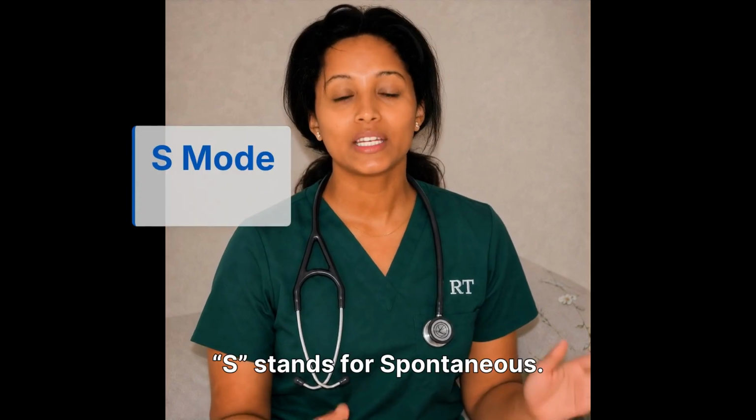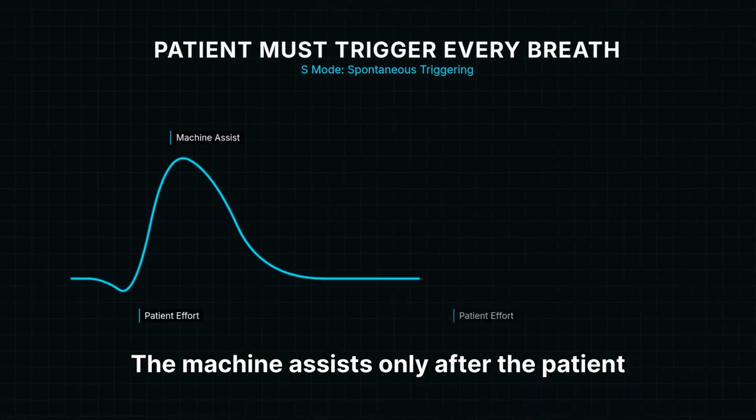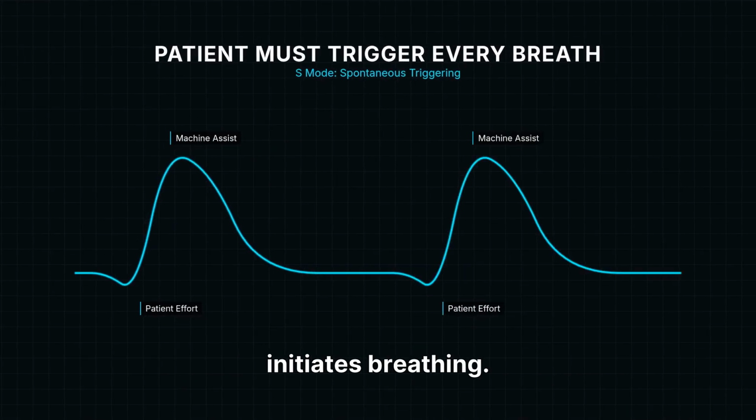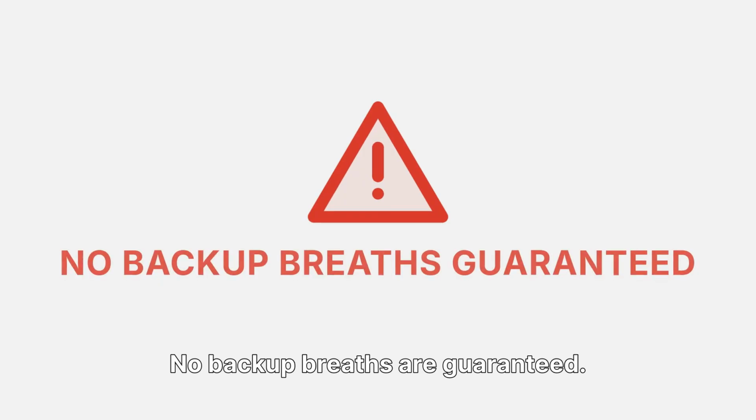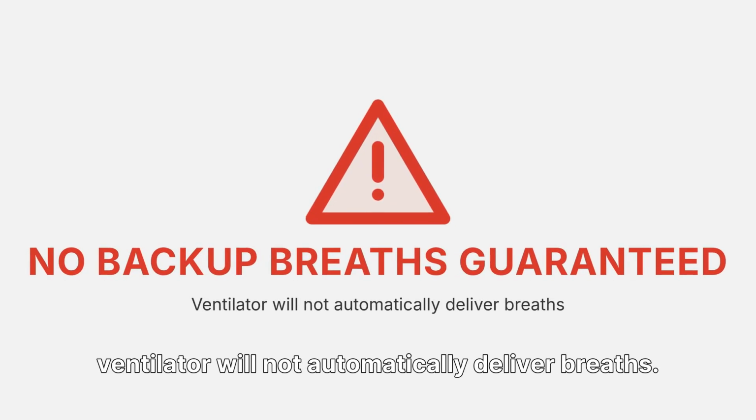What is S mode? S stands for spontaneous. In S mode, the patient must trigger every breath. The machine assists only after the patient initiates breathing. No backup breaths are guaranteed, so if the patient stops breathing, the ventilator will not automatically deliver breaths.